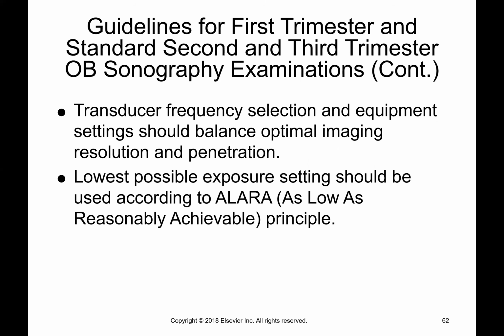Transducer frequency selection and equipment settings should be balanced for optimal imaging resolution and penetration. And you remember we're trying to strive for ALARA, which is as low as reasonably achievable. So we want it to be a great exam, but we also want to limit our exposure.